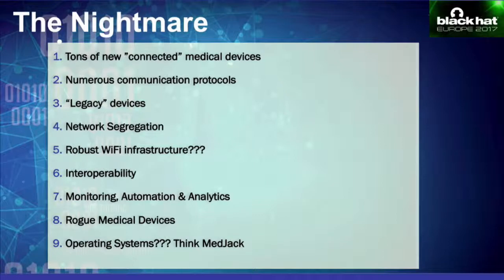These are your legacy devices that really had older firmware. They've been around forever, but just because they have a large lifespan, they are now being connected to the network. And the way these devices are being connected to the network also presents a huge risk, and I'll talk about it in the next slide.